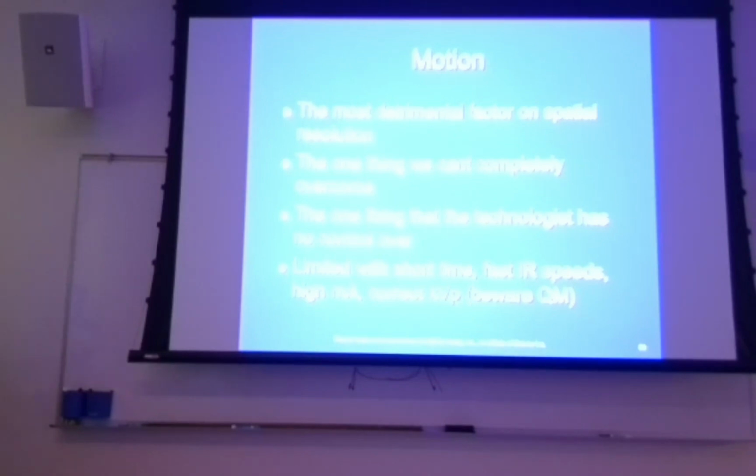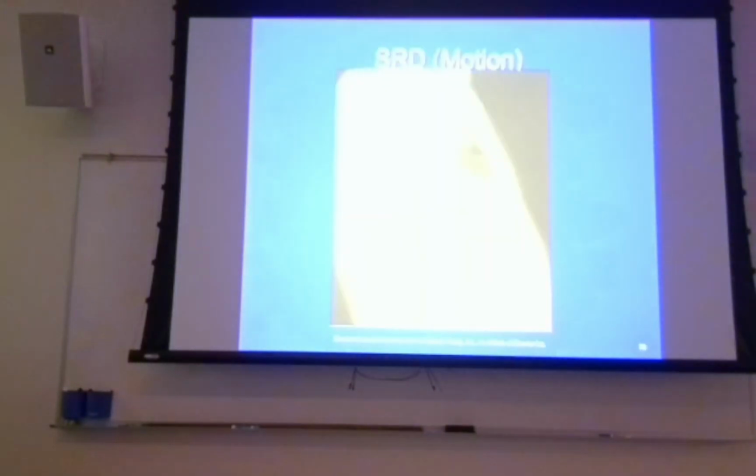Your tools are reduction of time, and how you reduce time would be fast image receptor speeds. You can't really control that anymore. It's set into the system, but if you can change your mA station to high mA station, great. If not, then you could use a higher kVp, but you might introduce quantum mottle. Unlikely, but it could happen. So motion looks like that.